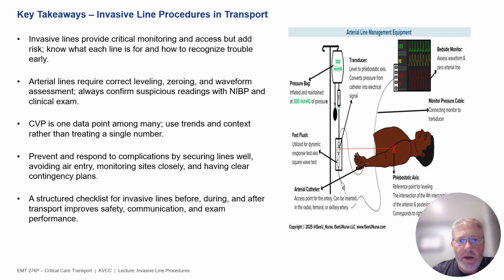Arterial lines are only as good as the waveform and the leveling. If either is off, then your numbers are going to be misleading. So make sure that you're diligent about leveling and zeroing those art lines before transport, so that you are confident that the readings you get during the transport are accurate.